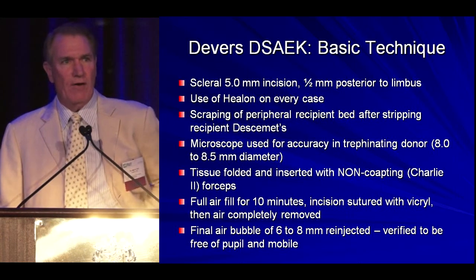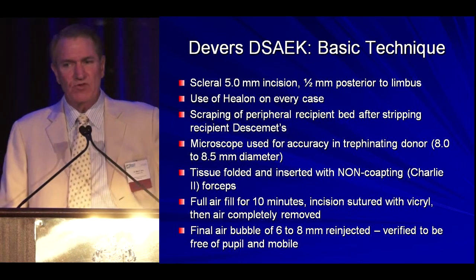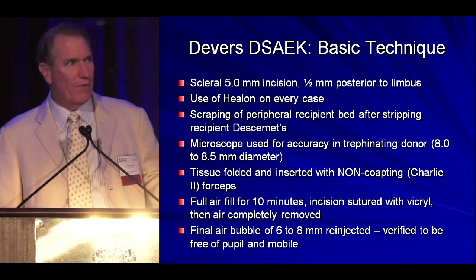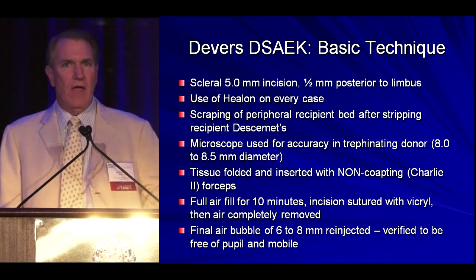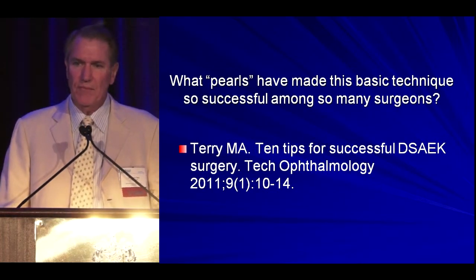And the reason I take all the air out is I want to make sure that I don't have any air trapped behind the iris. And if you've done your scraping properly and put the tissue in place and let it sit there and warm up to body temperature, the tissue will stick even though you take all the air out. And then you can simply put enough air in there to make you feel comfortable with the adhesion.